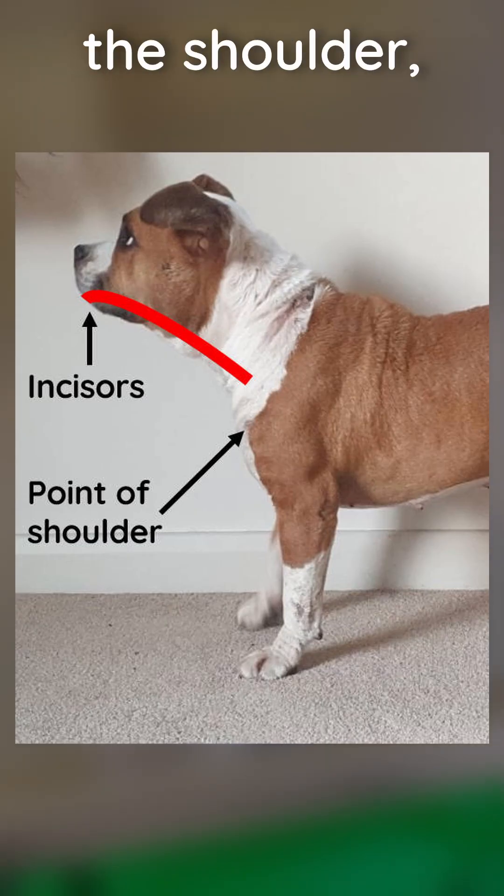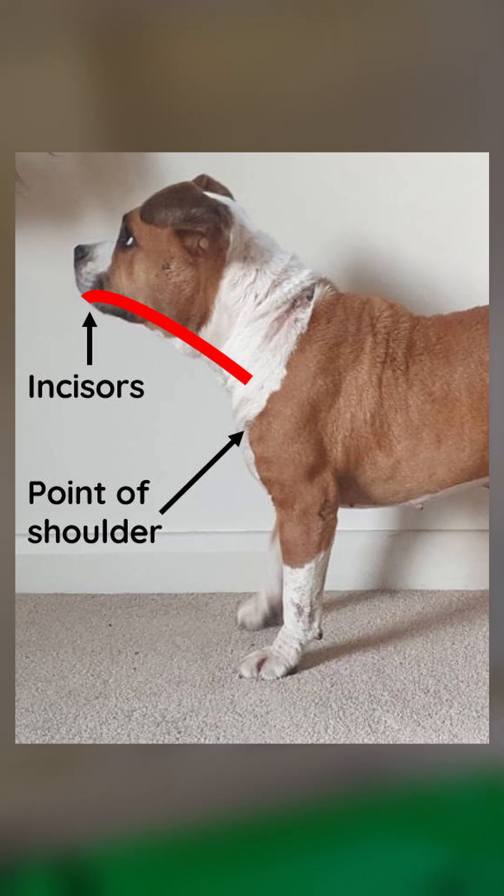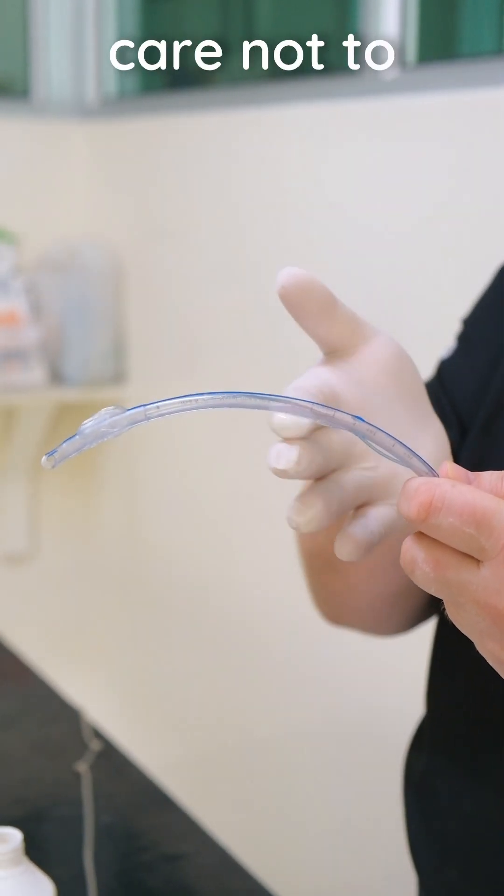Measure the tube from the incisors to the point of the shoulder to prevent advancing too far. Lightly lubricate the tube, taking care not to occlude it.